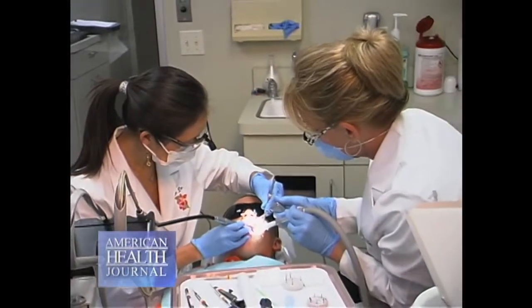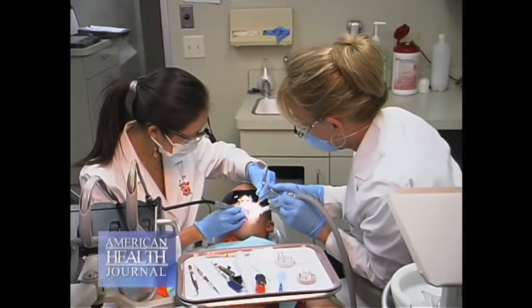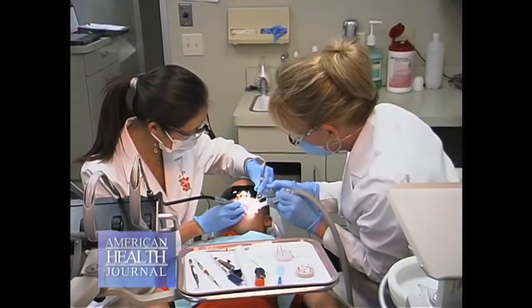If you think about the WaterLase, it's just using water to remove the decay that's in the tooth. You know how children are very, very squirmy — even if the kids move, basically all that happens is their mouth gets wet. So there is nothing more safe than the WaterLase because you can't cut the child. It's very, very safe.